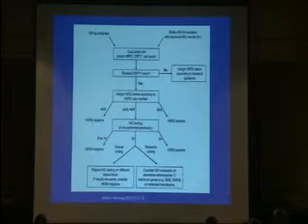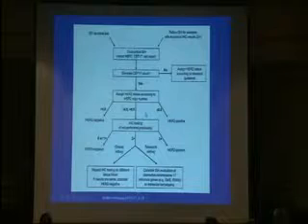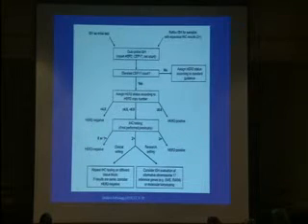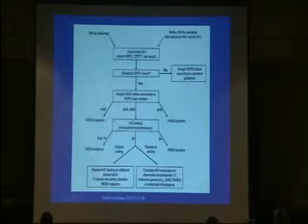So for now, the guidelines suggest that when we do the FISH test, whether it's the initial test or a reflex FISH test, and we see evidence of elevated CEP17, meaning that we see numerous green signals in the cells, we have to look at the HER2 copy number, regardless of the ratio. If you see 6 or more copy numbers, 6 or more red signals per nucleus, then that's a HER2 positive tumor, regardless of the ratio. If you see less than 4, that's a HER2 negative tumor. Between 4 and 6, that's tricky.